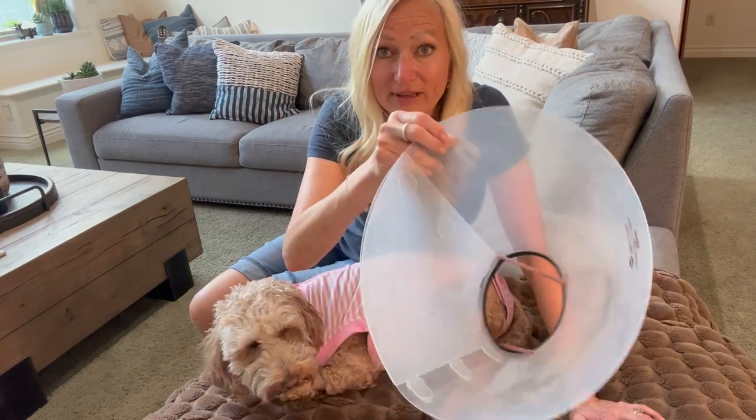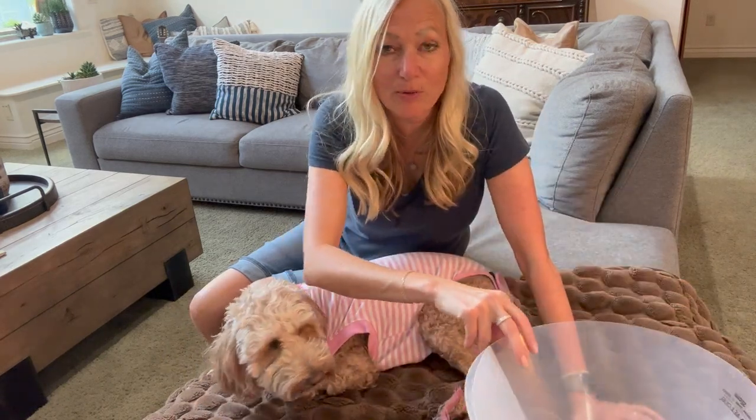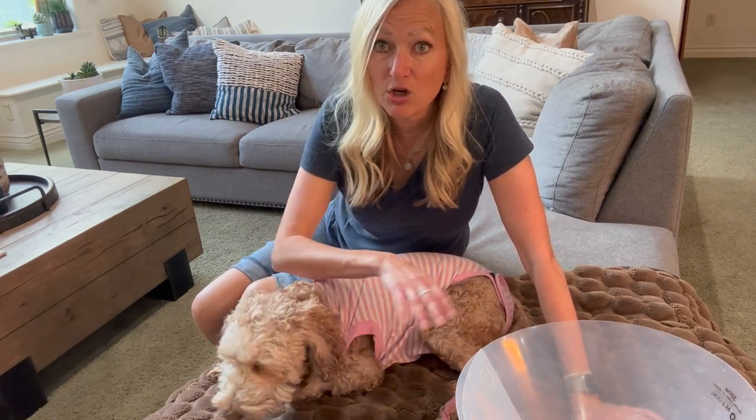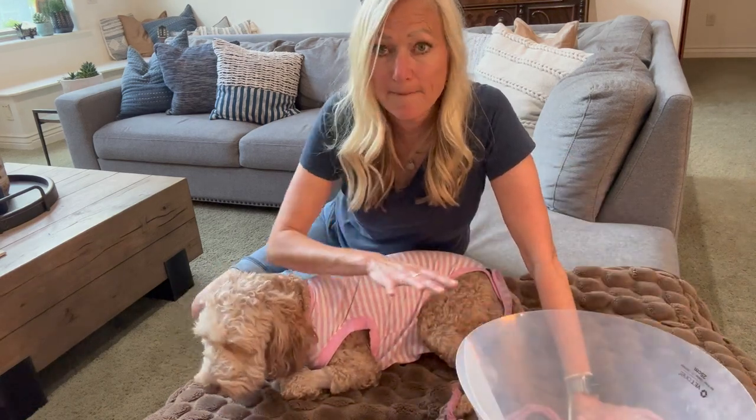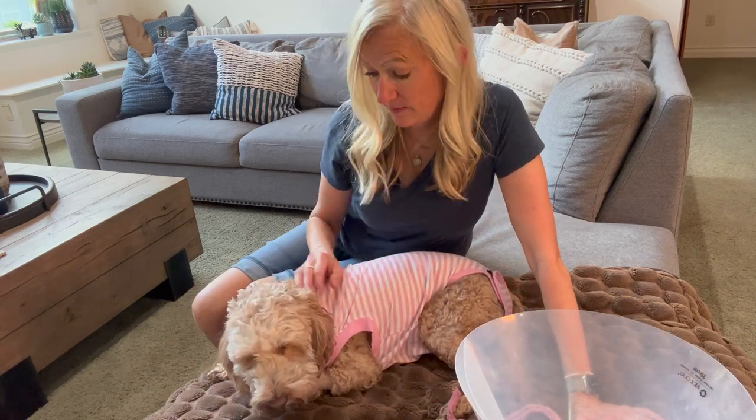The cone is actually really heavy, and when she would wear it all she would do is lay her head down and stay in the same spot I put her. Coco has done so well with this onesie. If you don't 100% trust your dog you can put the cone on when you go somewhere, but Coco's been so good — she doesn't bother it, she doesn't try to bite through it.